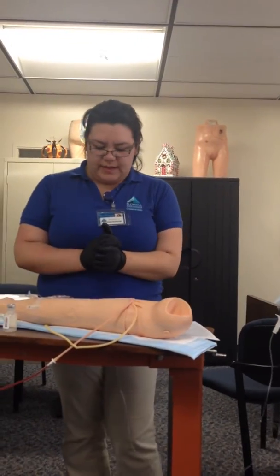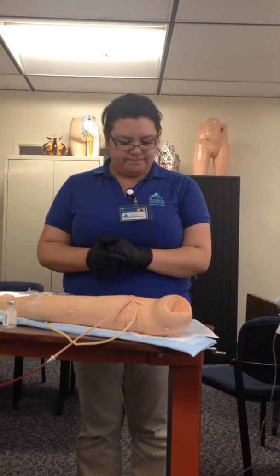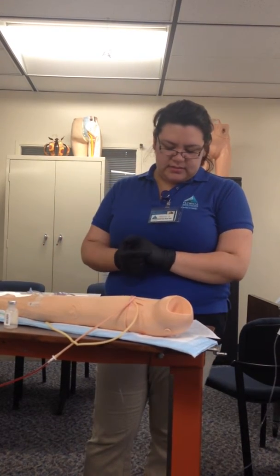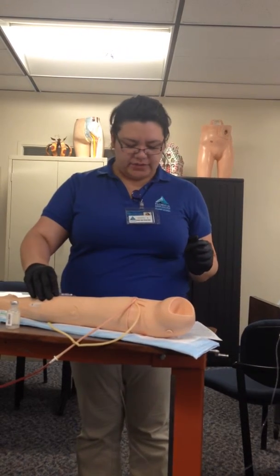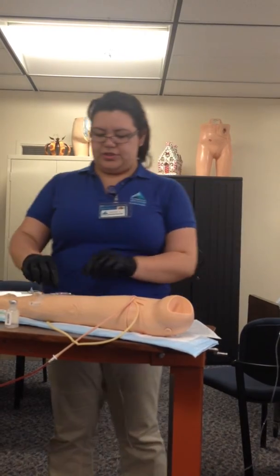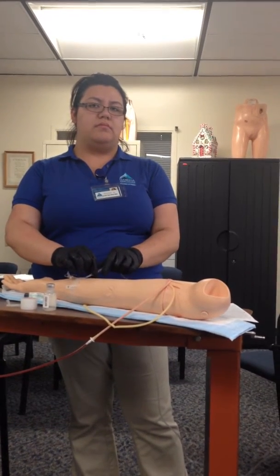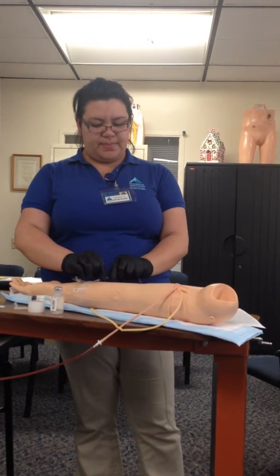So I'm going to observe the infusion periodically until it's complete. I'm going to wash my hands and take off my gloves using aseptic technique and just observe for signs and symptoms of any adverse reactions. Okay, so now I'm going to unclamp the tubing. It's going to infuse over 1 hour.